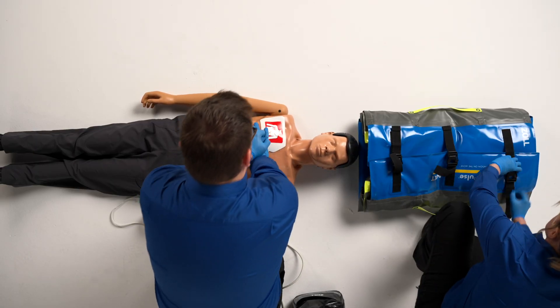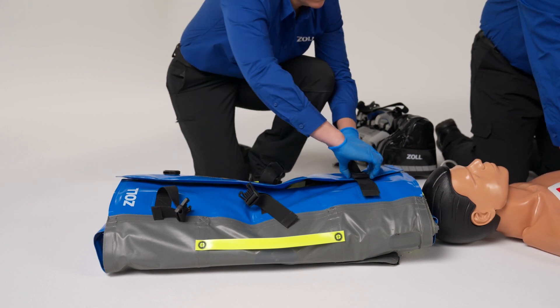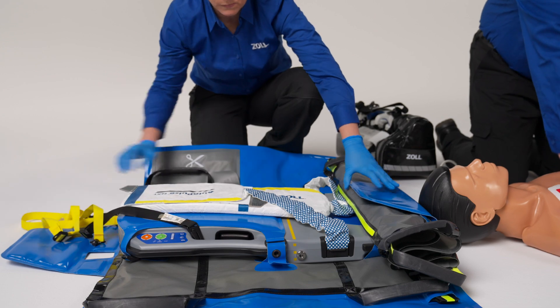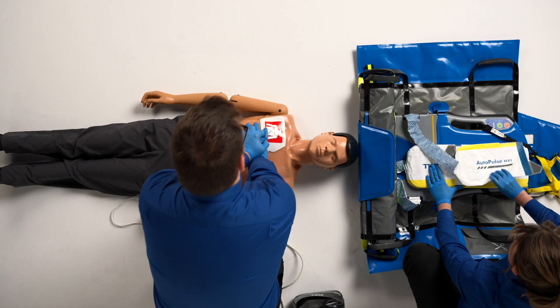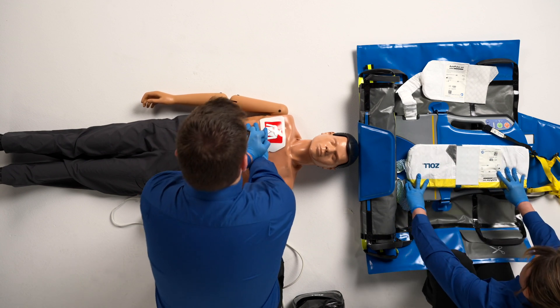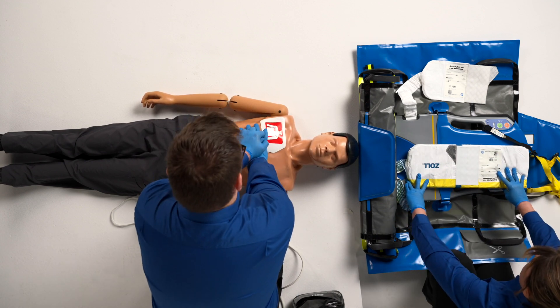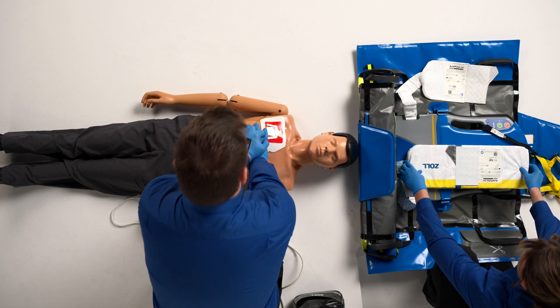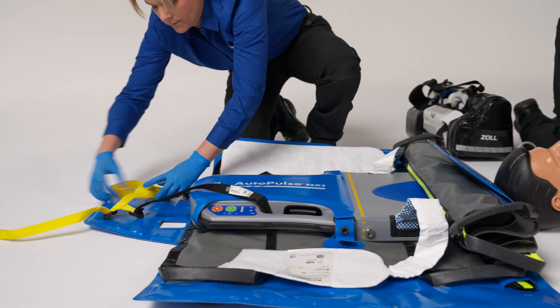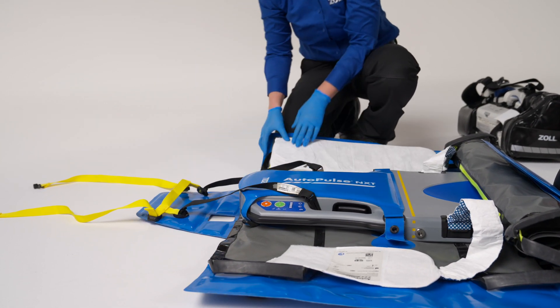To deploy the AutoPulse NXT Resuscitation System on scene, first position the device above the patient's head and open the blue panels of the Quick Case Carry Sheet. Open the AutoPulse NXT band. Take the shorter part — the section with the tab — and place it to the left, parallel to the left side of the board. Then place the longer part to the right, parallel to the right side of the board.